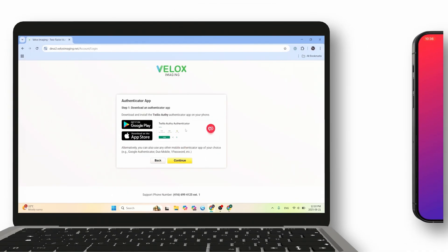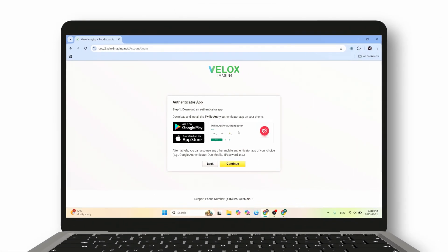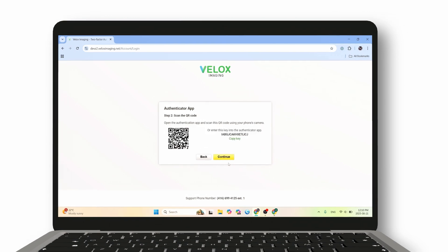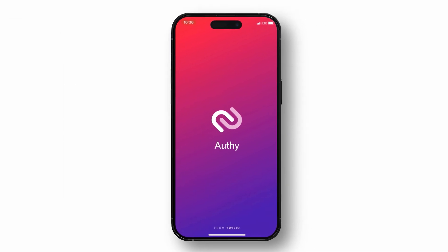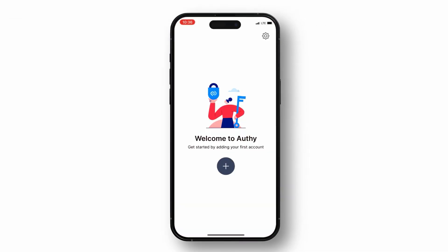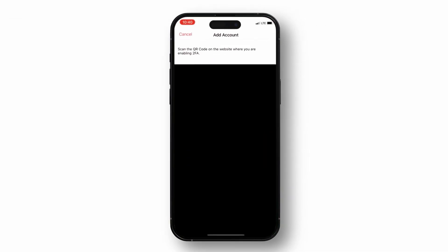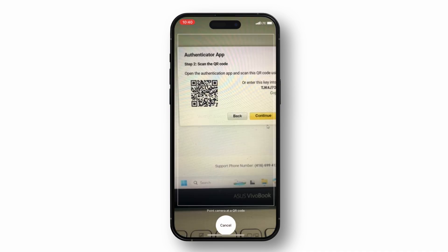Once the app is installed on your phone, you're ready to link it to your Velox Imaging account. On your browser, click Continue and a QR code will appear on your screen. Now open the Twilio Authy app on your phone, tap to add a new account, and use your phone's camera to scan the QR code displayed on your computer screen.